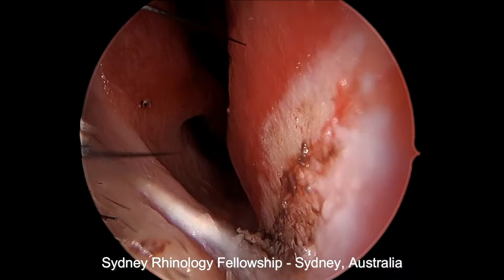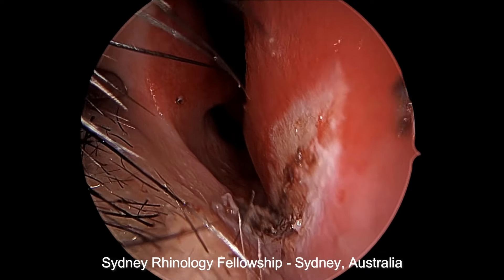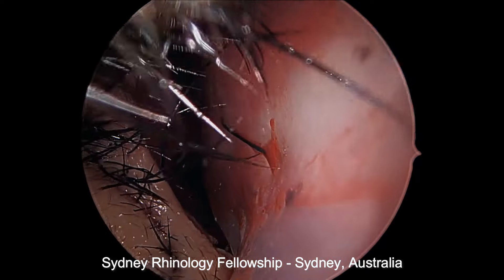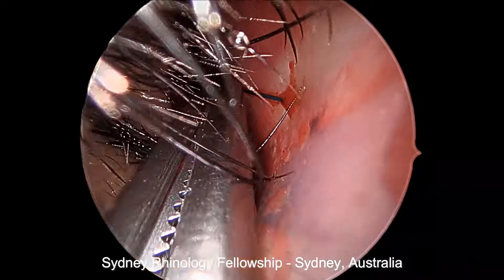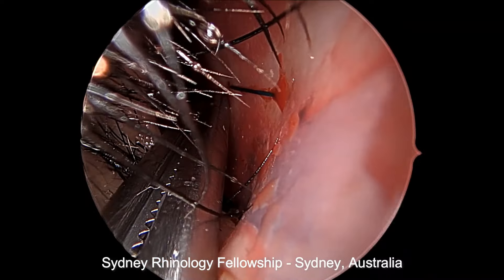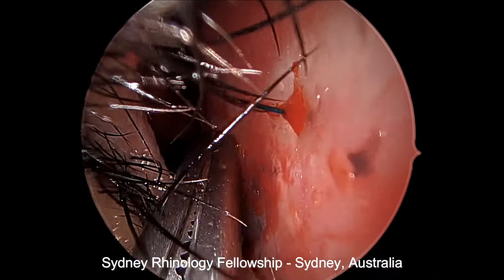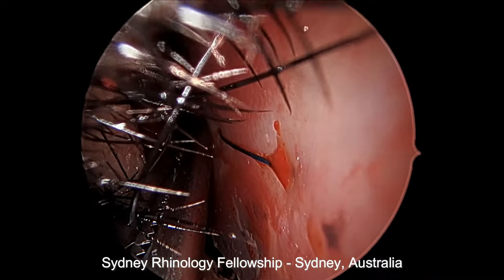At the end, it should be a limited thermal injury, and importantly — and often over-missed — is the need to cover the area to prevent crusting, as it is in a high nasal airflow site.